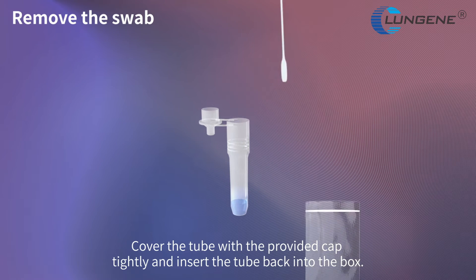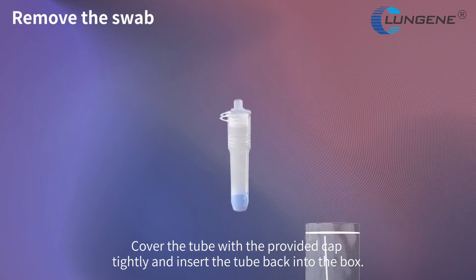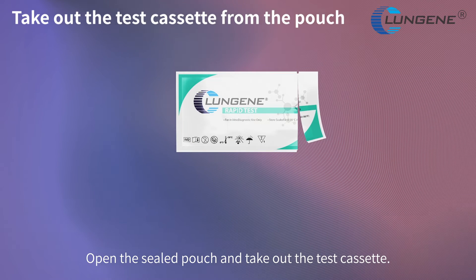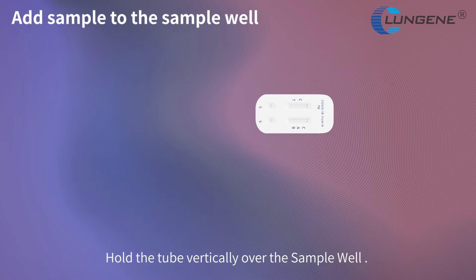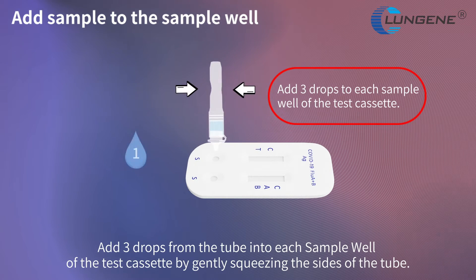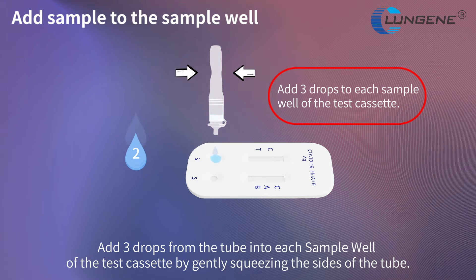Remove the swab while squeezing the sides of the tube against the swab to release the liquid from the swab. Cover the tube with the provided cap tightly and insert the tube back into the box. Open the sealed pouch and take out the test cassette. Hold the tube vertically over the sample well and add 3 drops from the tube into each sample well by gently squeezing the sides of the tube.